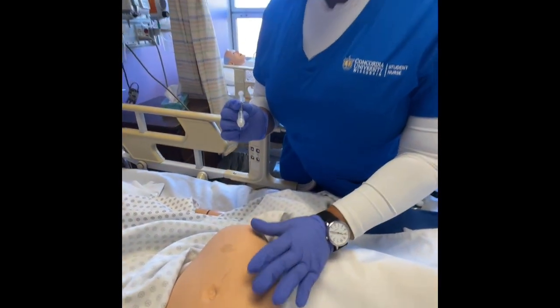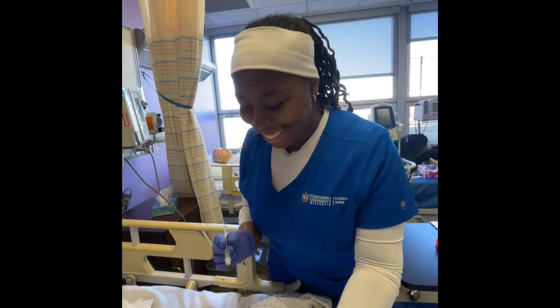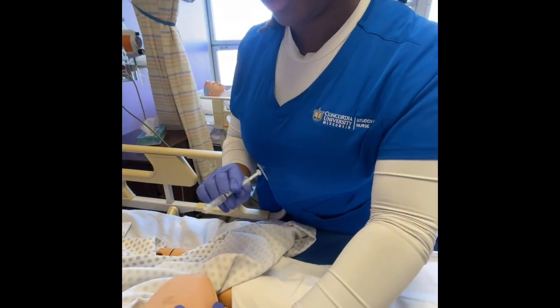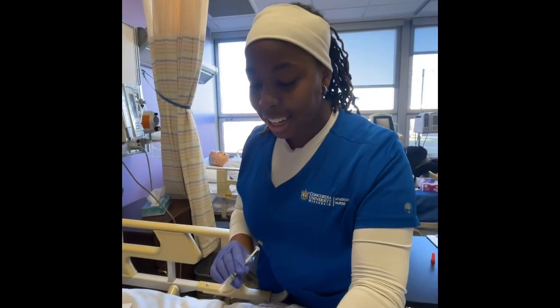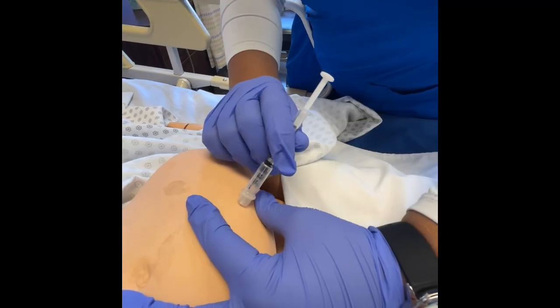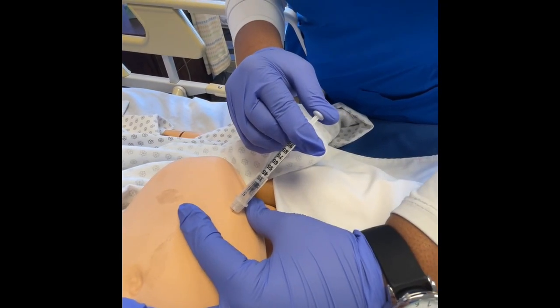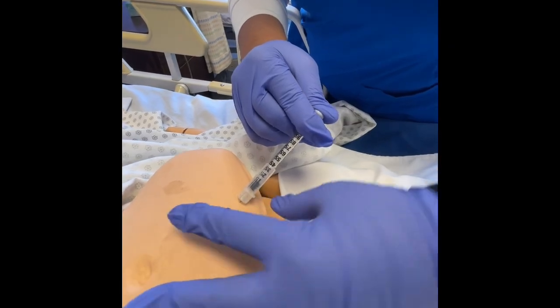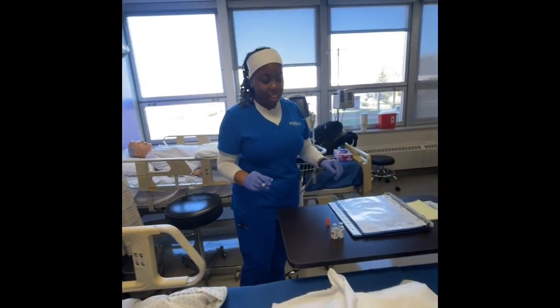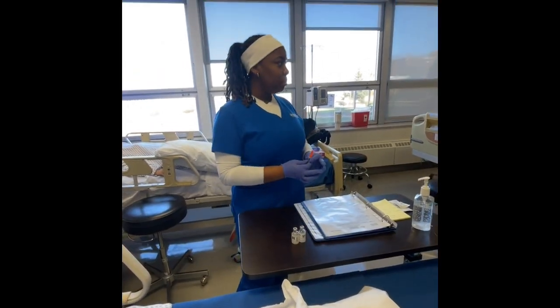Then you would find your site. You kind of want to squeeze the area. I can't. But you would want to squeeze that fatty area and hold that skin still. And then because Martha is a little skinny, we're wanting to go at a 45-degree angle. And then we'll just poke. And then insert it slowly into Martha. Good. And then you just want to release. And if she's bleeding, you want to just dab her up with an alcohol wipe, cap. Put it in the sharps.